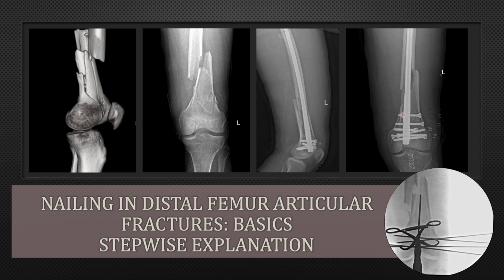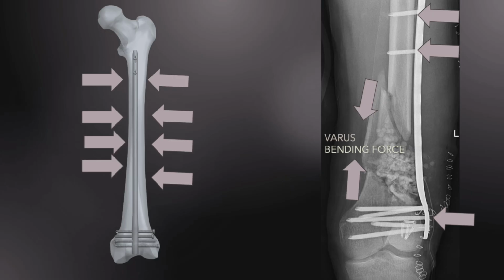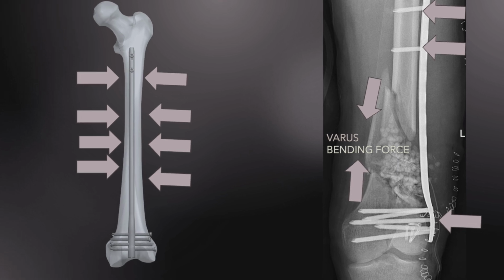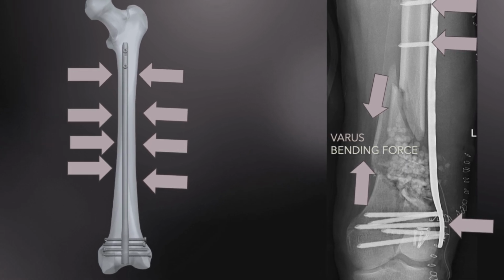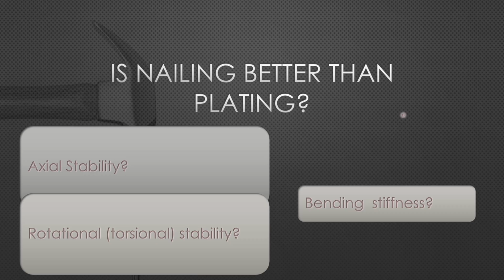So in this video, we'll be seeing what are the basic steps for fixation of distal femur fractures, especially the articular ones, using intramedullary nailing. First of all, we should be aware why nails have better stability than the plates alone. The axial stability, the rotational stability, and the bending stiffness is definitely better with the intramedullary nail because the nail is getting hold inside the intramedullary canal. Unlike the plate, which is going to cover only one particular surface, the nail is going to uniformly distribute the stresses throughout the circumference of the intramedullary canal, that means the whole of the diaphysis.